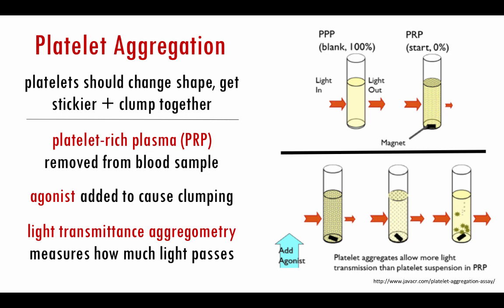We want those platelets to work, and when they're working, they stick together, and in this situation, they fall out of solution. If they all stay homogenized in the solution, that's a sign that they're not able to be triggered and activated. So it's a little bit indicative that something is functionally wrong with the platelets.